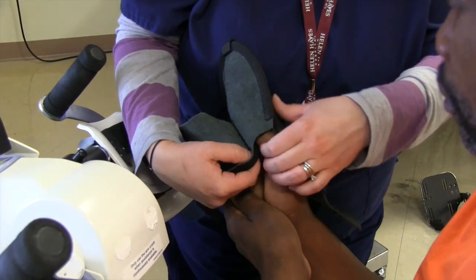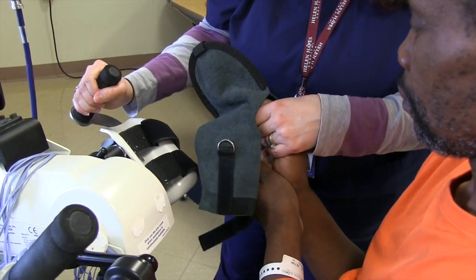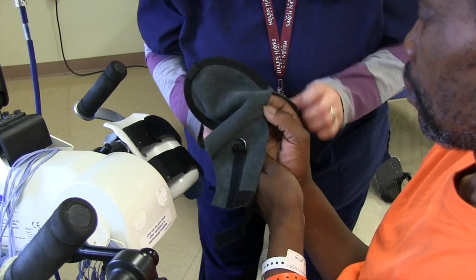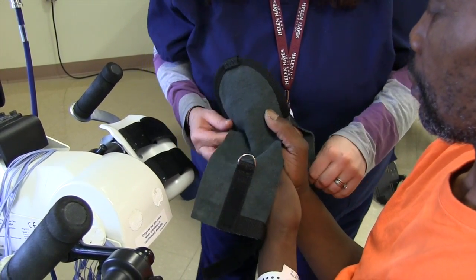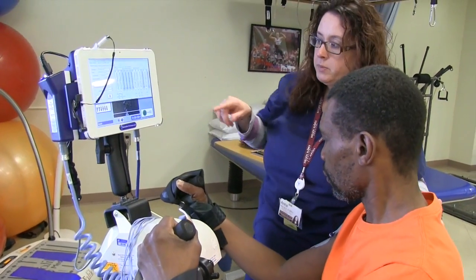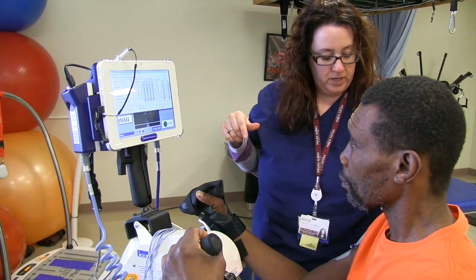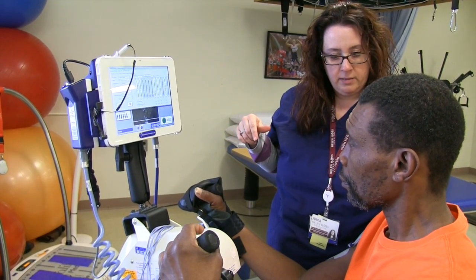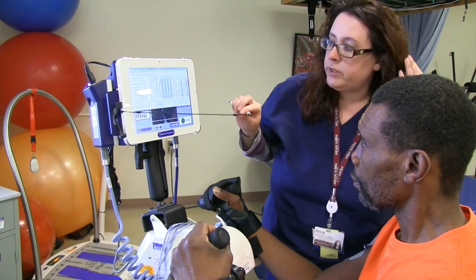I'm putting this mitt on him just to help him grip the handle better. Since his grip is a little on the weaker side, this just helps keep his hand on there. I'm going to put the electrical stem up on every muscle that I put the electrode on, so just let me know if it's too much or too little.